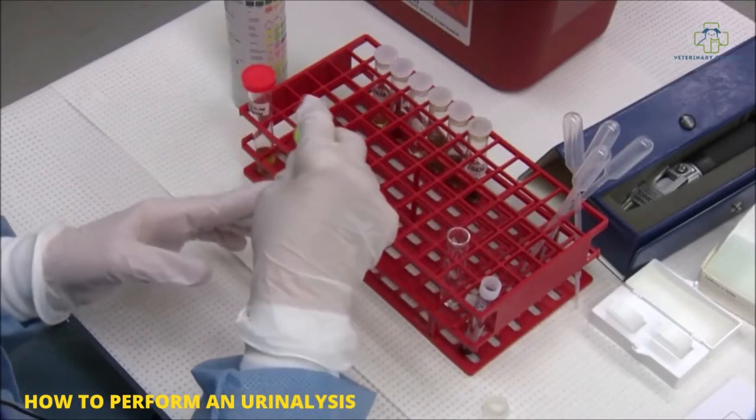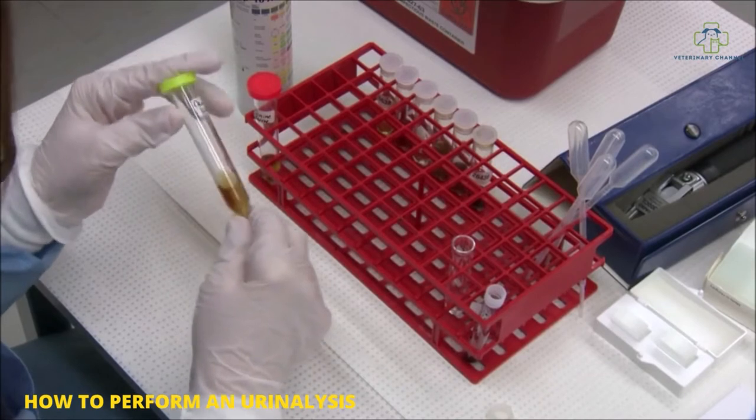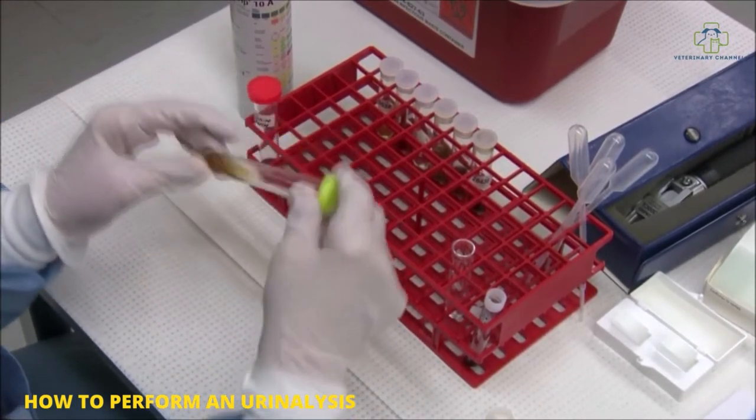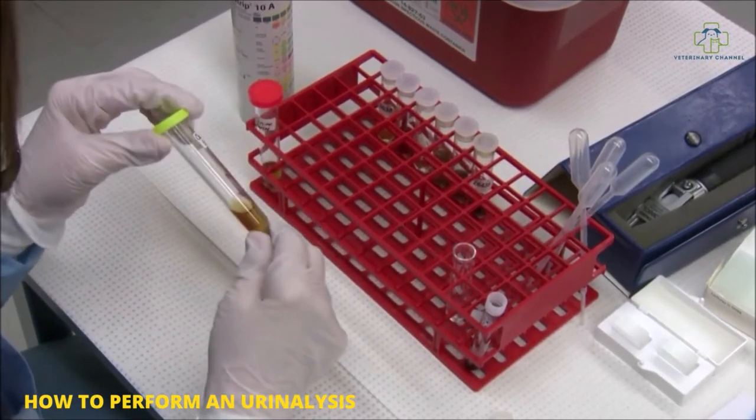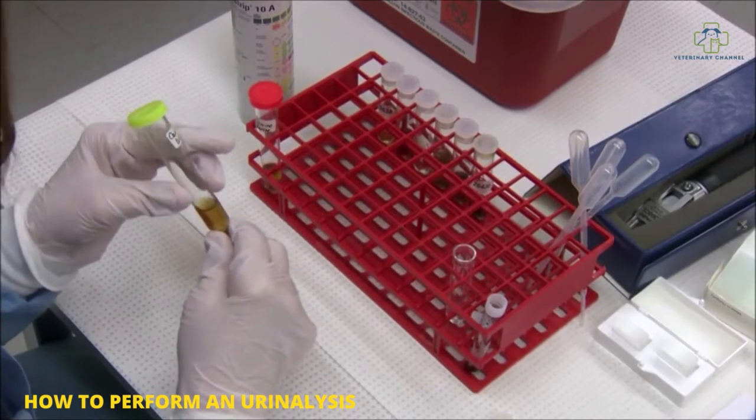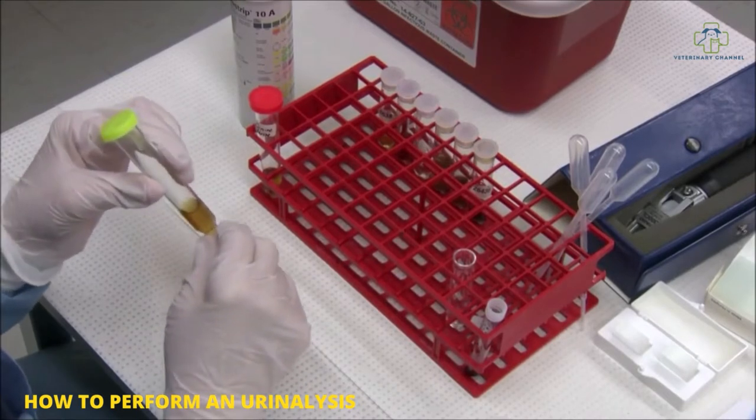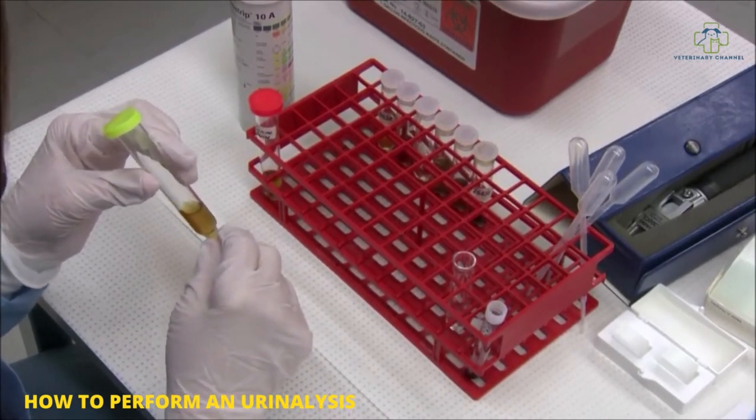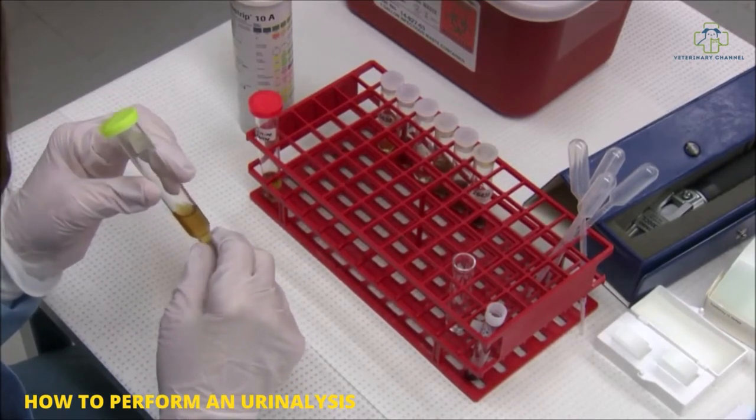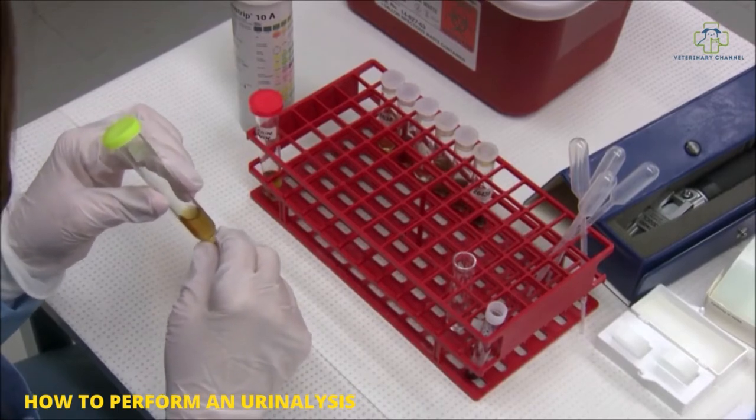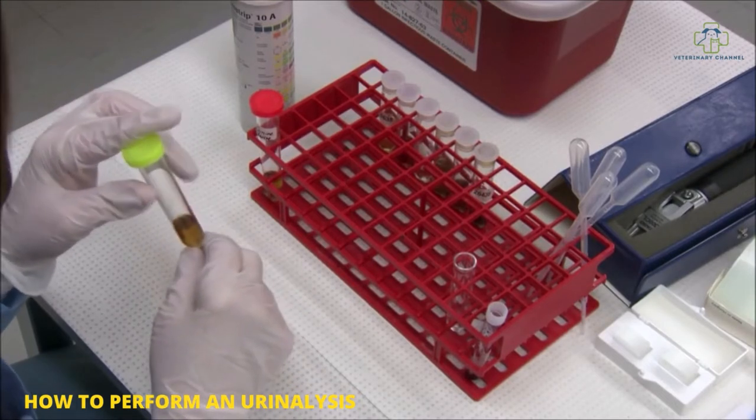Today I'm going to show you how to do a routine urinalysis. We start with 3ml which is used for interpreting microscopic sediments. If you get less than 3ml, you should record it on your report form. It's important to analyze your urine as soon as possible after collection. If you do refrigerate your urine, you need to let it warm for 30 minutes before testing, as the strips are meant to react at room temperature. Be aware that crystals may form in urine that has been refrigerated.